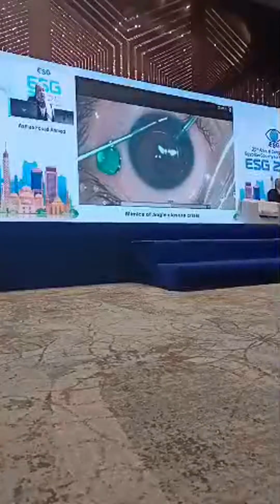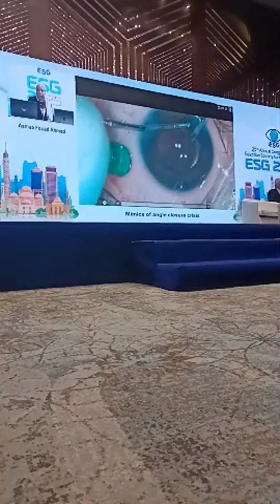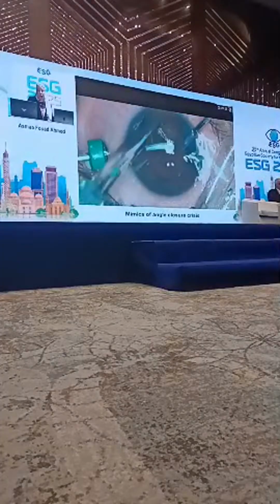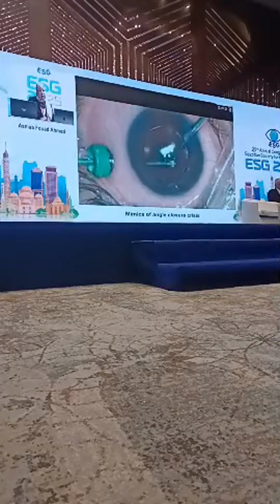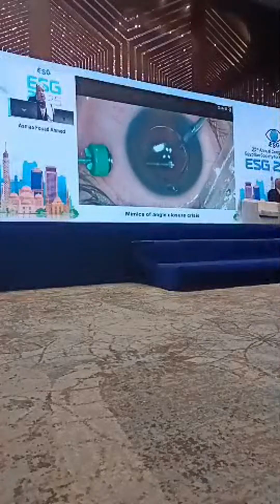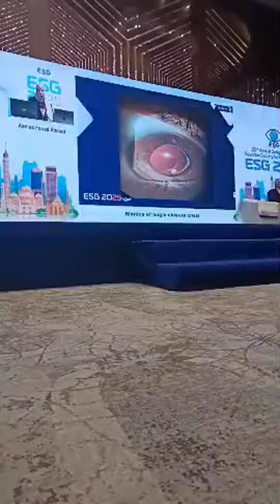Followed by peripheral iridectomy using vitrector to communicate the two compartments, posterior and the anterior chamber. And doing posterior capsulotomy, anterior hyaloidotomy, anterior vitrectomy to release the trapped fluid in the vitreous space. The end point of the surgery is deepening of the anterior chamber. Post-operative 6 months.